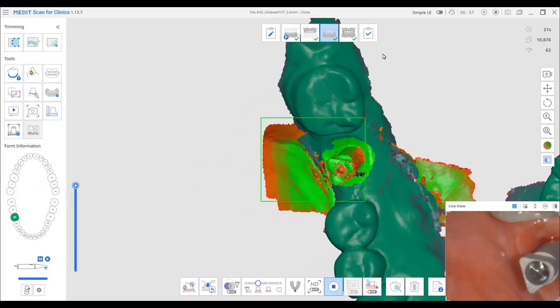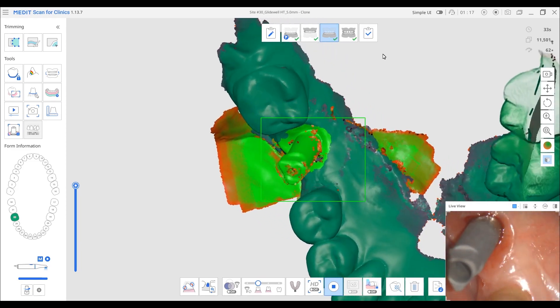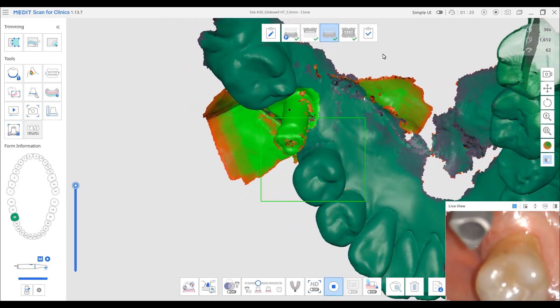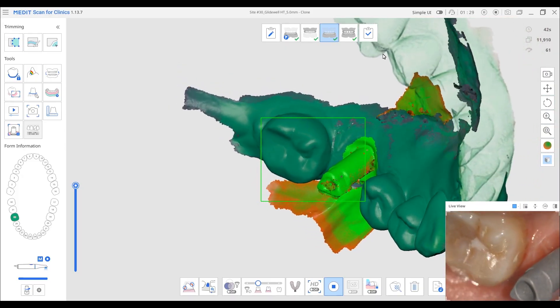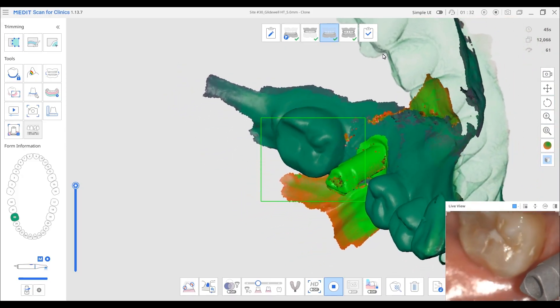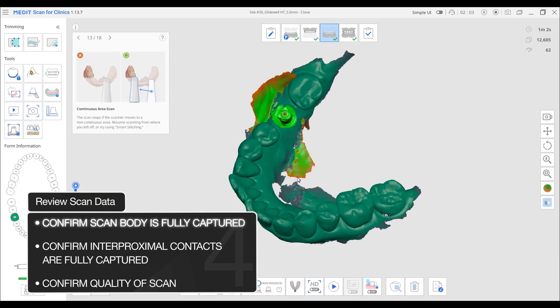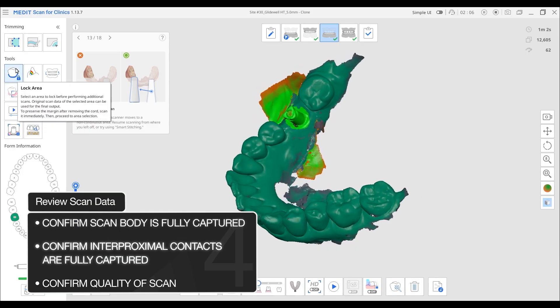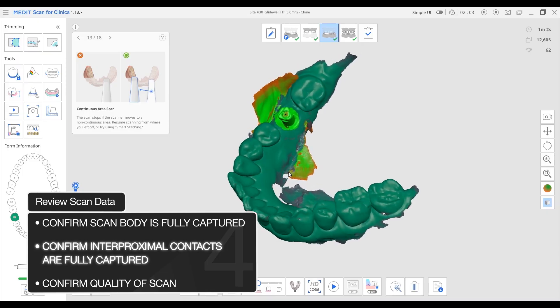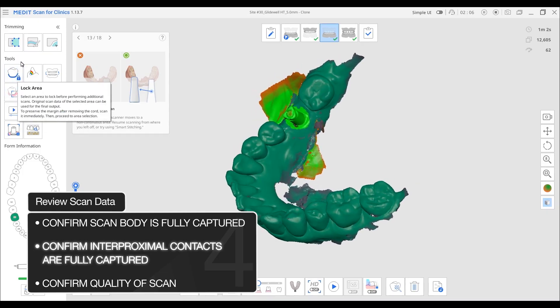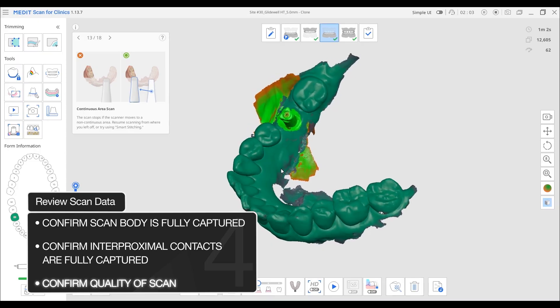During this phase of the scan, be sure to simultaneously acquire the peri-implant soft tissue and emergence profile. Pause to inspect the digital model for stitching errors or voids, and rescan any areas if needed. With scanning complete, review the digital model from multiple angles. Inspect contact points, ensuring that the preparation or scan body is clearly captured and free of voids or artifacts. A few extra moments spent here can prevent remakes later.